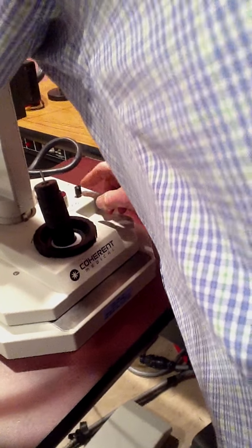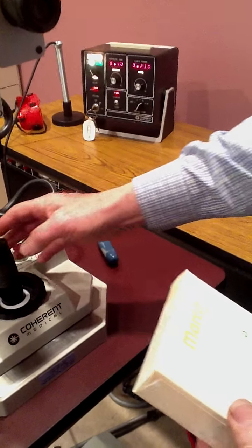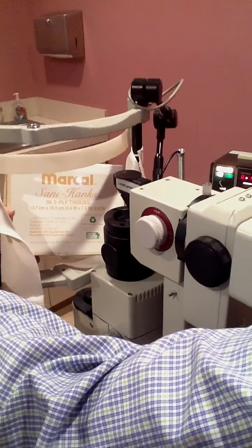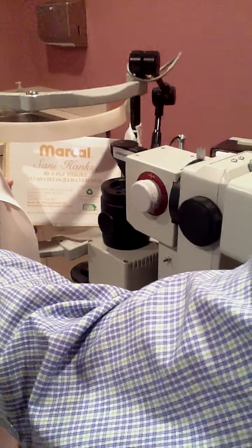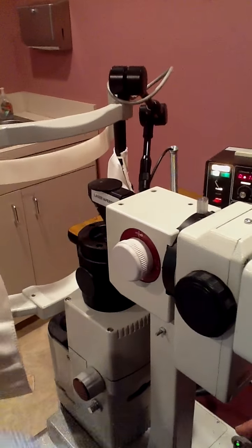One other thing — if you want to move the aiming beam, we have a switch over here. You press this down, and then you can move the aiming beam with this little rod here. See how that moves? You want to have it right on the white light. Then we press down on this to lock it in place.